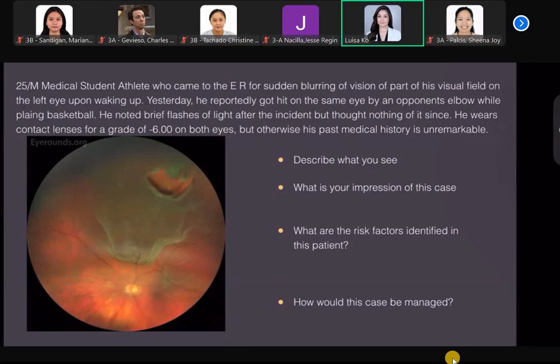Another thing that you want to do in pars plana vitrectomy is, you guys are familiar with what welding is, no? You use lasers to weld the tear back, like you fix the hole with a laser. And then while you wait for the scar tissue to form for it to reattach after the laser, that's the purpose of the gas bubble or of the oil.